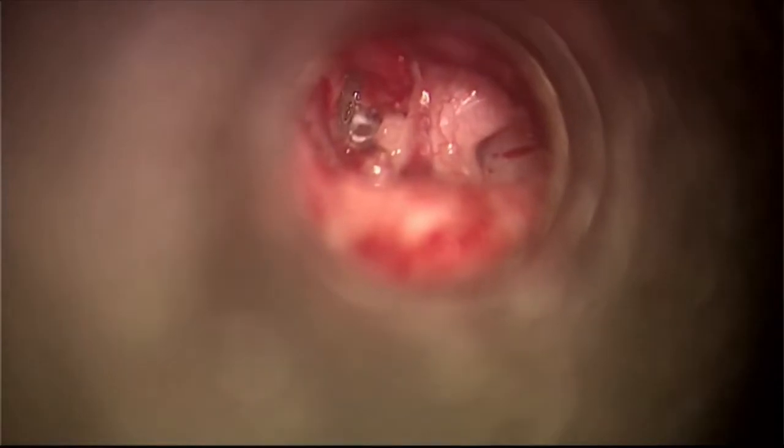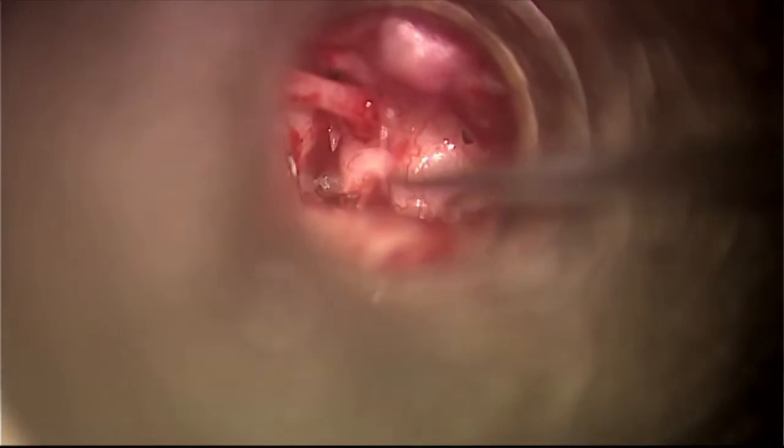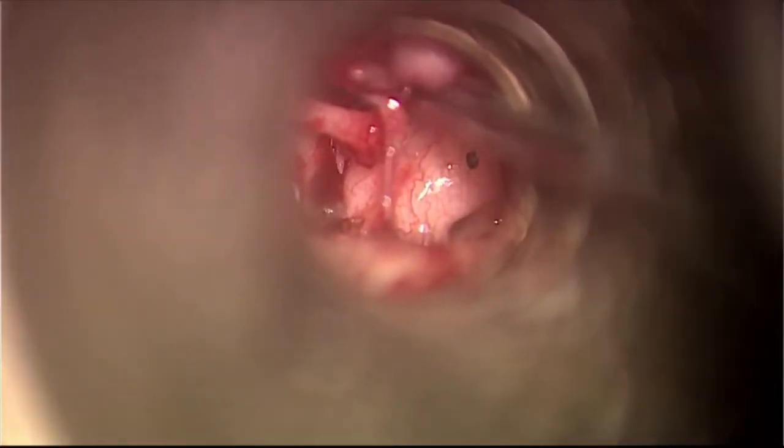Now, once it is weakened, I can quickly break it. See this? How easily I can break it. See that? Very nice. And the anterior crus rarely gives a little bit of problem. Can you centralize a little bit? Yes, that's nice. The anterior crus is broken easily. Beautiful.